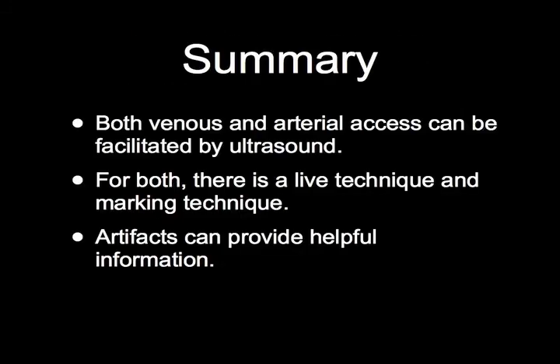Summary. Both venous and arterial access can be facilitated by ultrasound. For both, there is a live technique and a marking technique. Artifacts can provide helpful information.